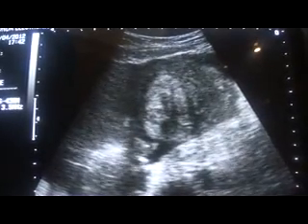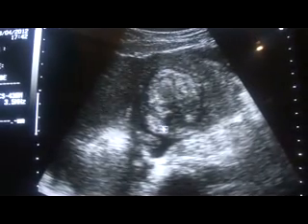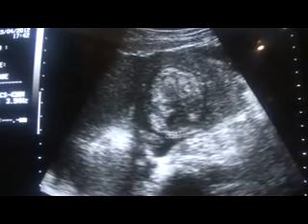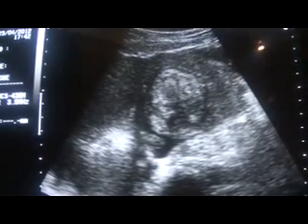This is fluid. These are the bowels, and this is the uterus. This is the anterior wall of the uterus. This is the fundus, and the mass is in the posterior wall.